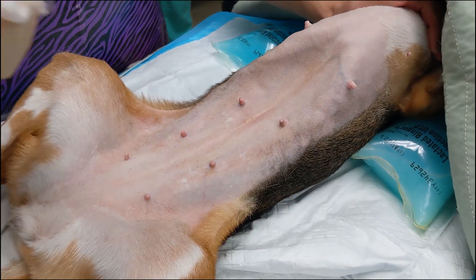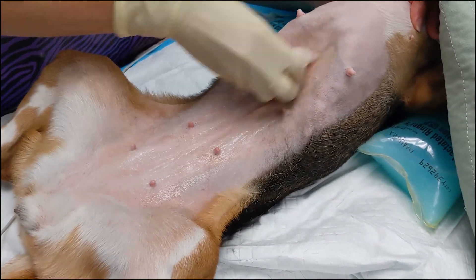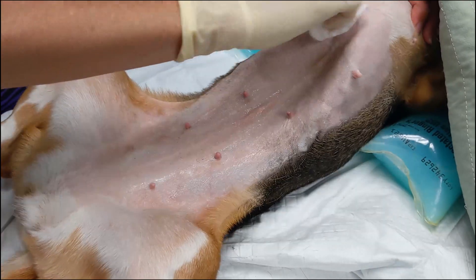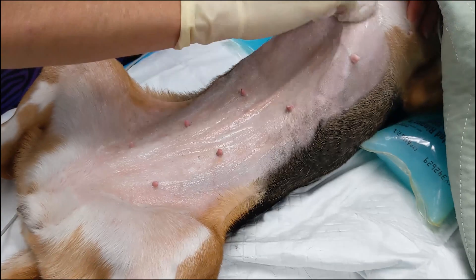In the induction area, an initial dirty prep is performed. The purpose of this prep is to scrub away dirt and debris and to start contact time with the chlorhexidine scrub. For this scrub, non-sterile gloves can be used.